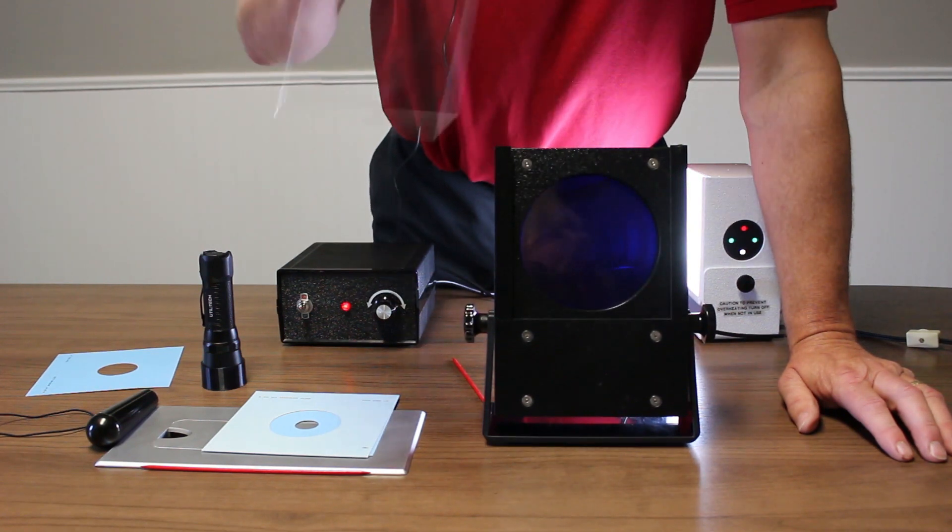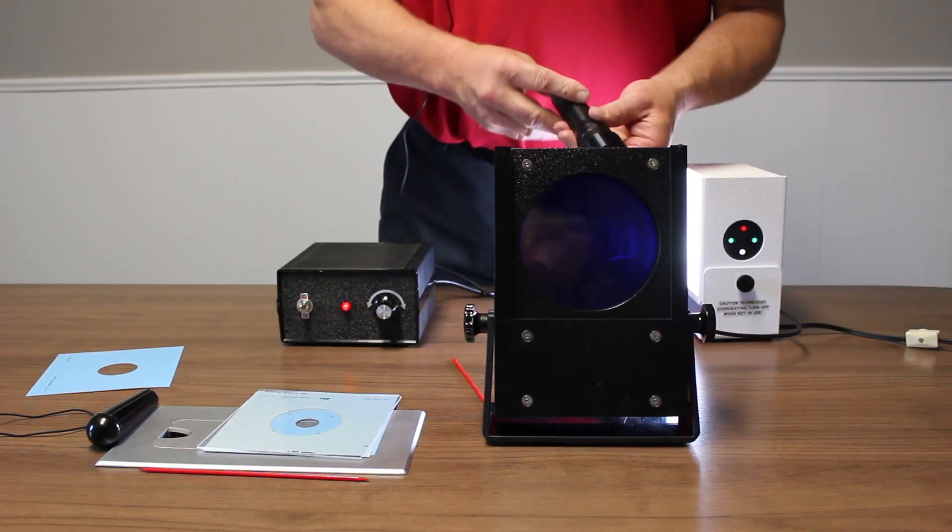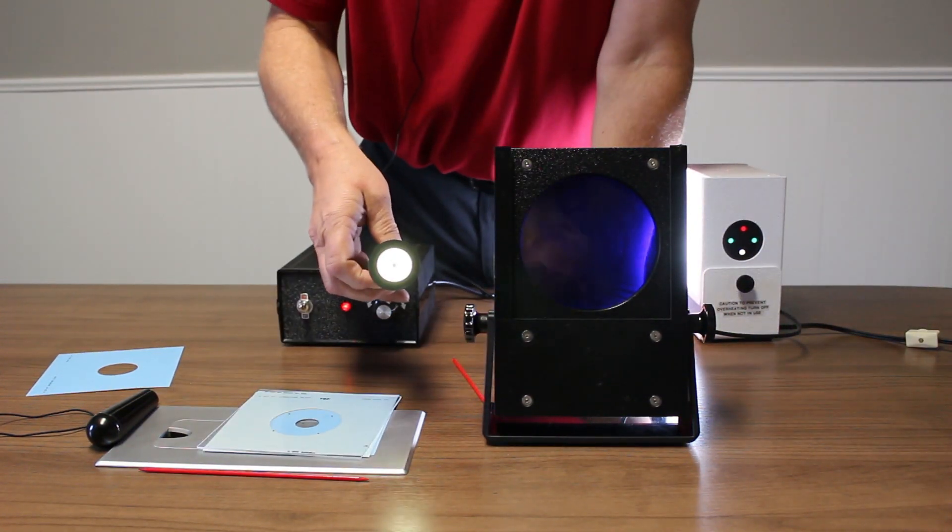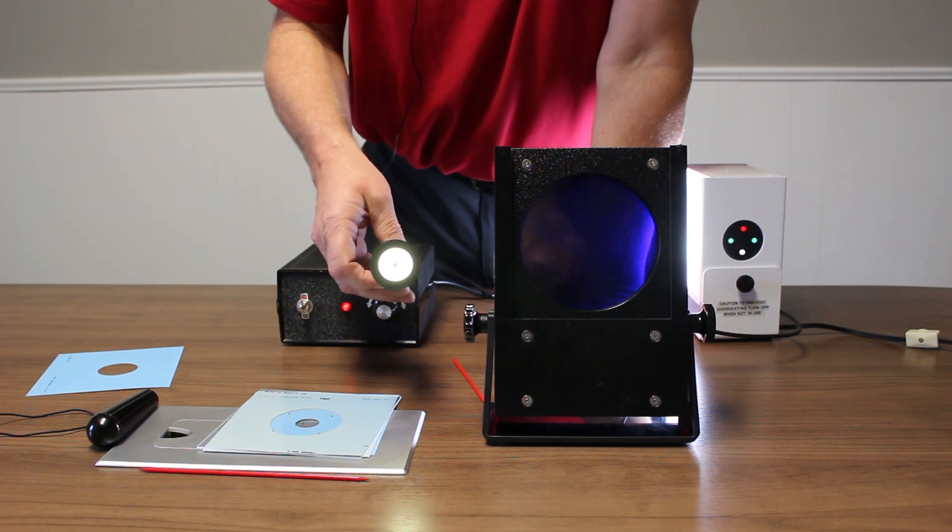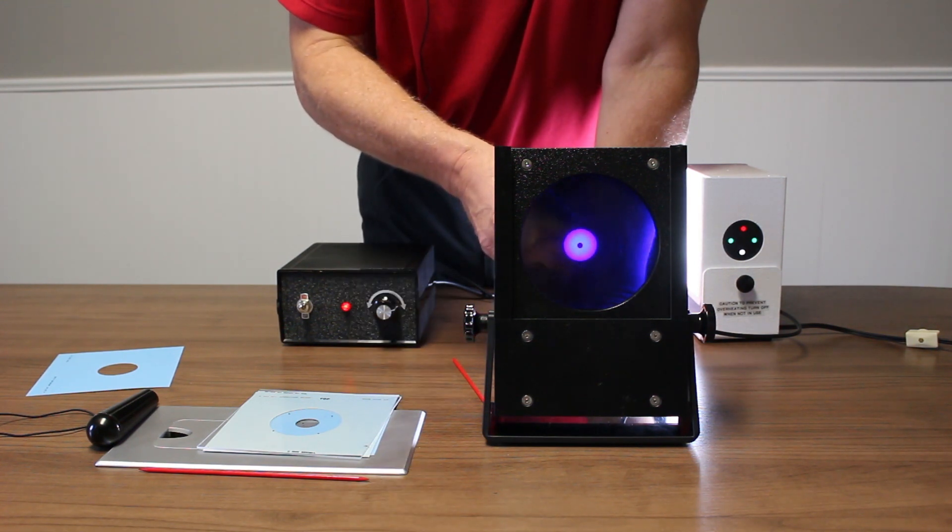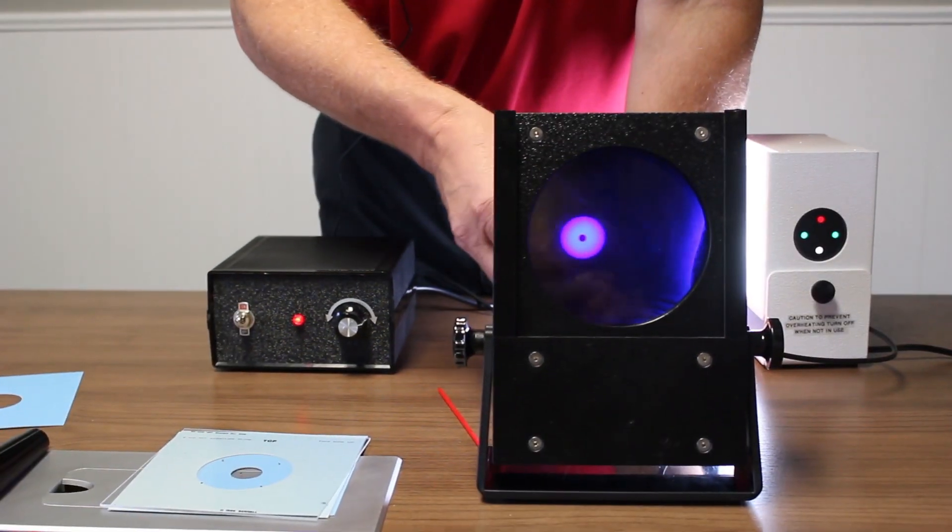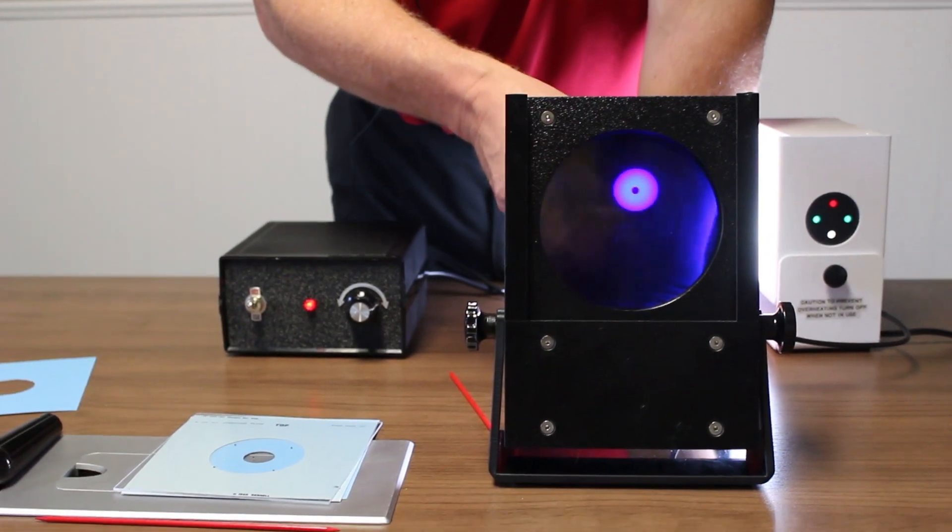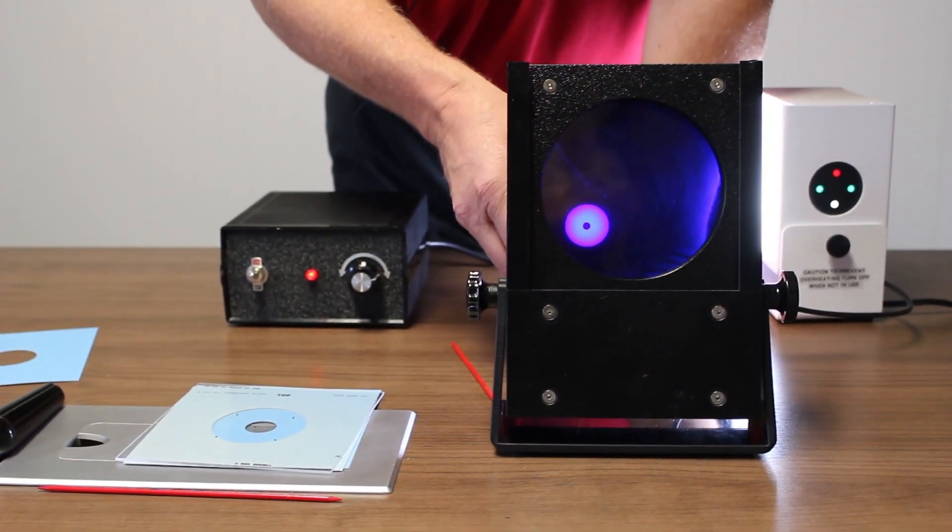We'll get rid of this target for a moment and we'll put a flashlight behind it. Notice the flashlight's very bright with a black dot in the center. You're going to move this behind the MIT, have them look at the black dot, get the propeller spinning around it and then move it from side to side, have them track, have them follow the light.